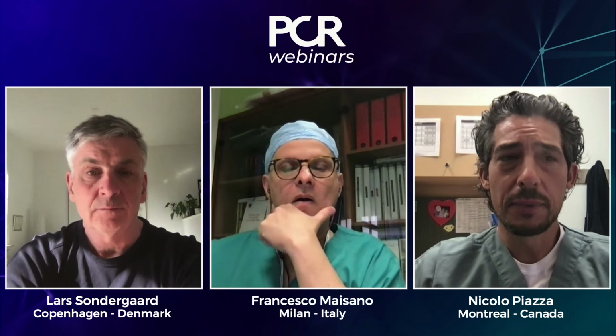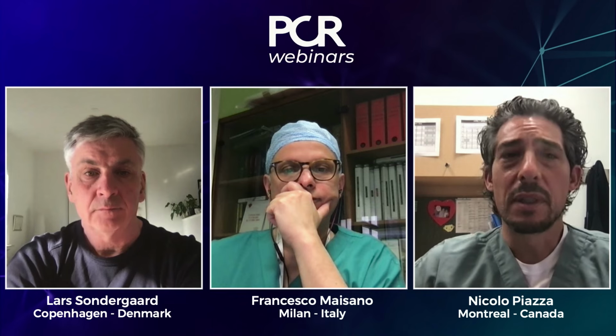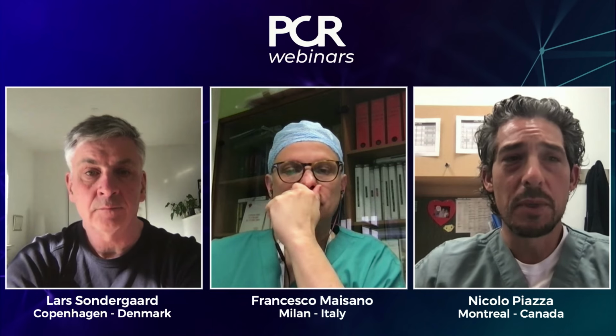Okay, Nico. Any comments on the choice of valve and the procedure here? Anything you would have done different in a case like this in your institution? No, Lars. Look, I think you selected the right valve size. You chose a self-expanding valve. We were also discussing before the webinar, what type of effective orifice area does a 25 millimeter Portico give you? It's approximately 1.7, similar to a 26 Evolut.